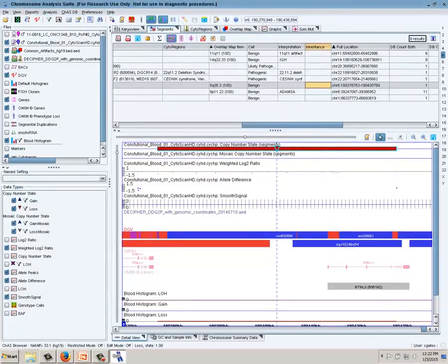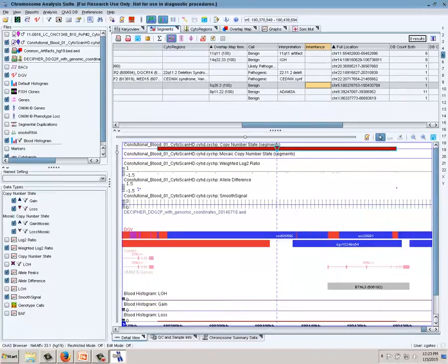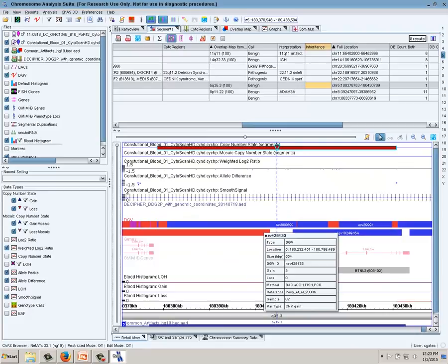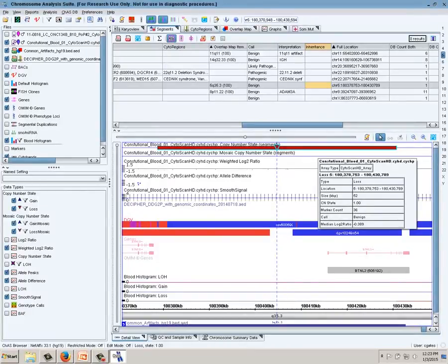You can also query directly from the segment itself down here, but again, it's going to give you overlap or coverage thresholds as opposed to both. And same with the histogram, you can also get to that segment intersections. Whether you have a segment or not, it's really just going to give you the segments that are represented in that particular region of the histogram.